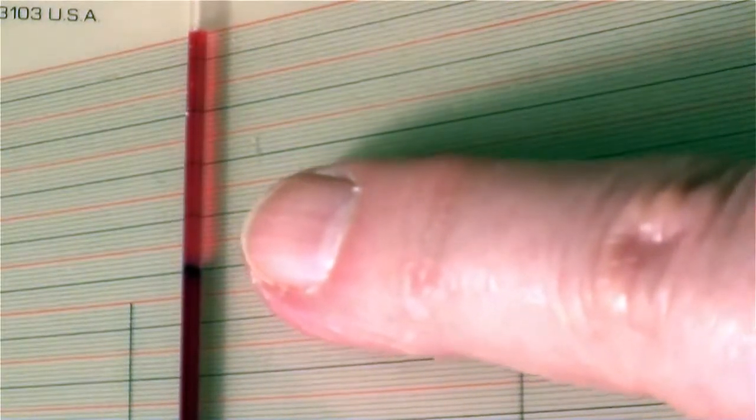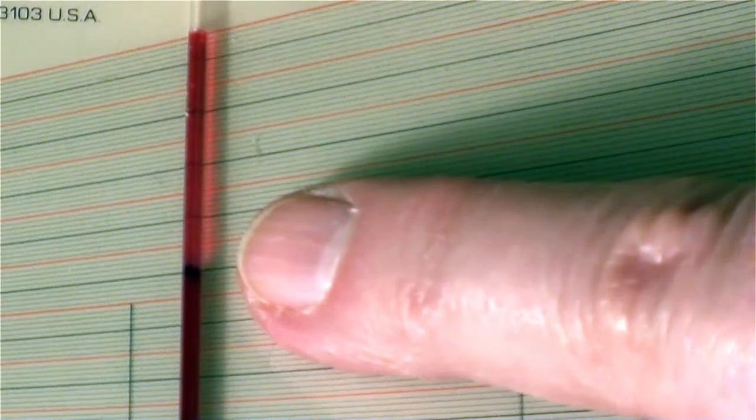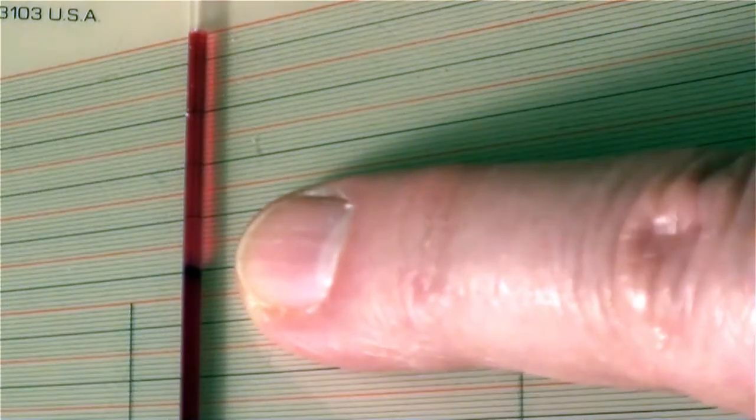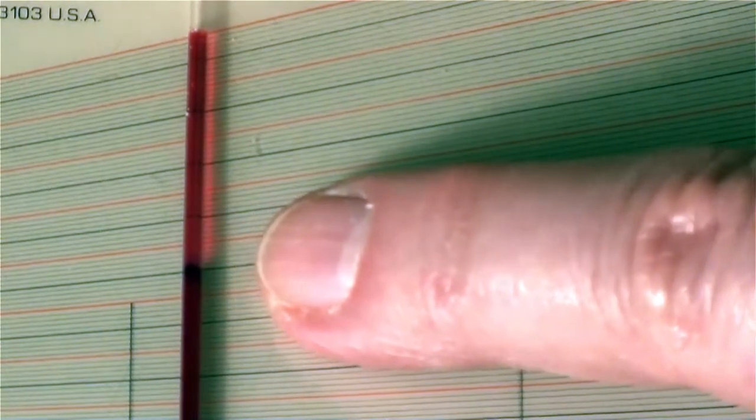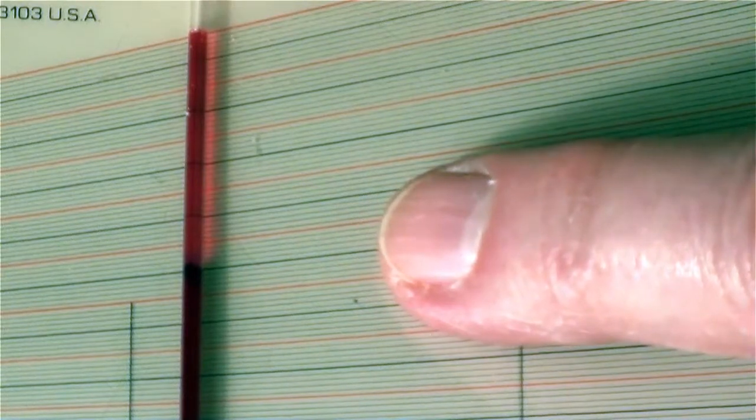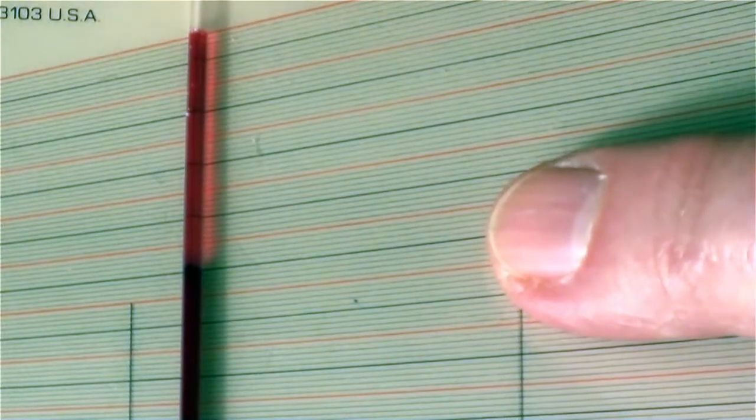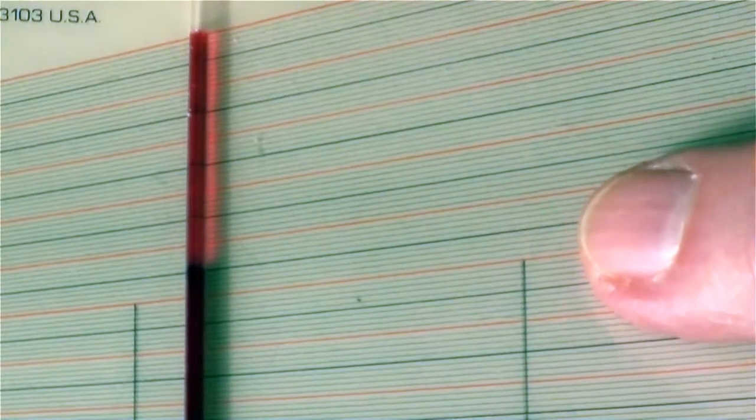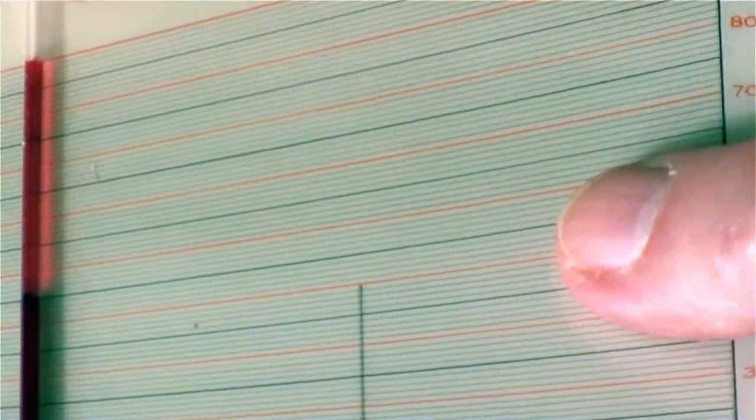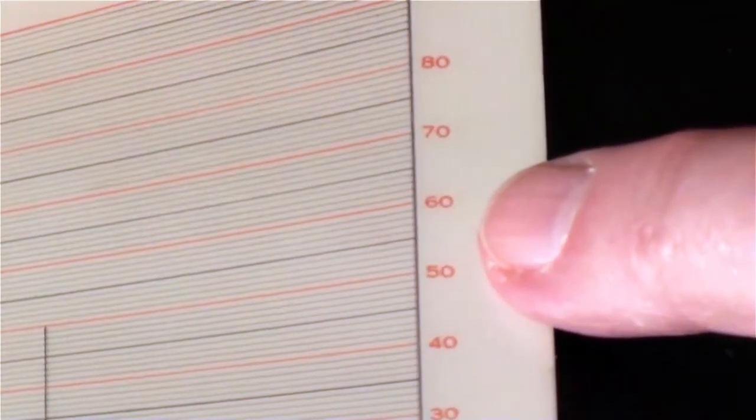Now we look right here at the top of the packed blood cells. That level of blood is laying against this dark blue line. If I follow it to the side, what I'm going to do is find a number.